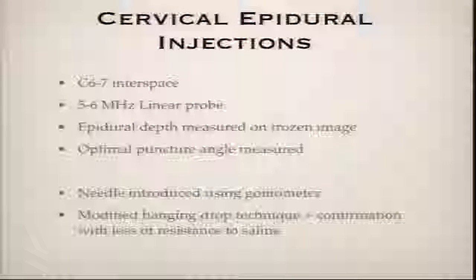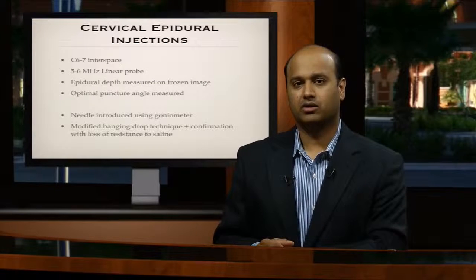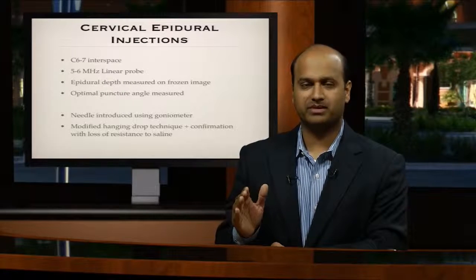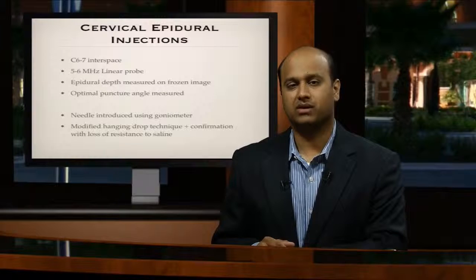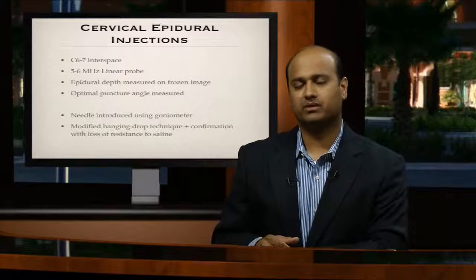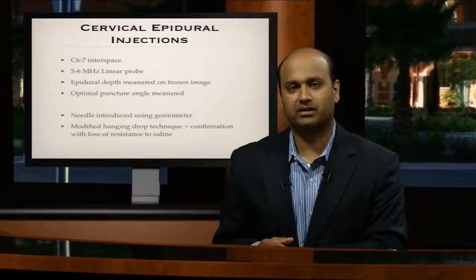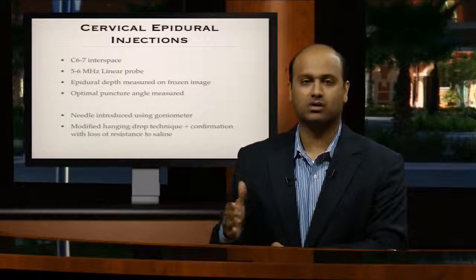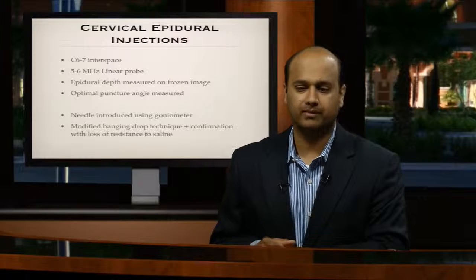One thing of note is when you measure with the ultrasound, you're often compressing the skin tissue, and so the depth from the skin to the epidural space on the ultrasound image is slightly less than the actual depth that you'll have to penetrate the tissue with your needle, because that compression is no longer there once the ultrasound is removed.